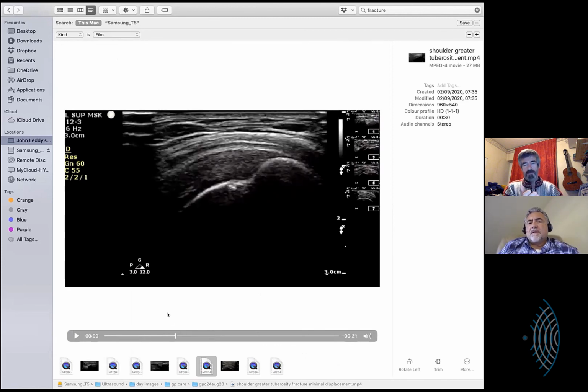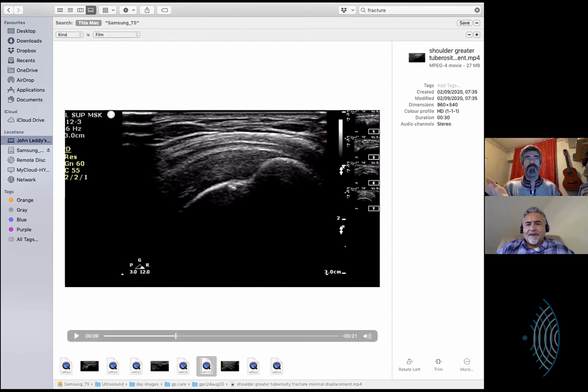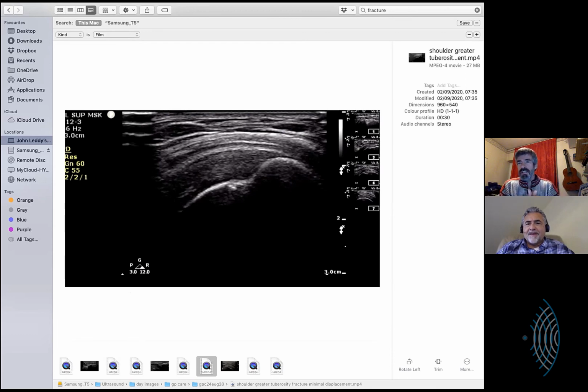Because if there is a step down, and that step is vertical, and for some reason you get a bit of osteophyte or changes in the bone, they can sit like that. If you imagine a spur, the shape of a spur in the heel, it has almost like the anvil type effect on a cumulonimbus sort of thing. Yes. And you get that in very small, and you have your various slice thickness issues, and you get this appearance there.